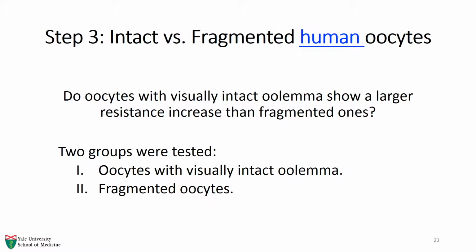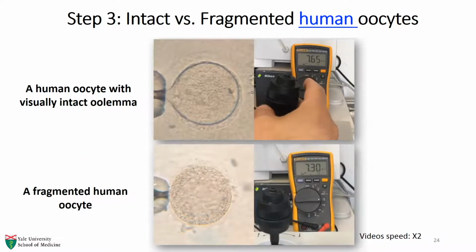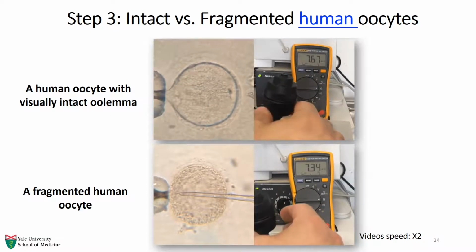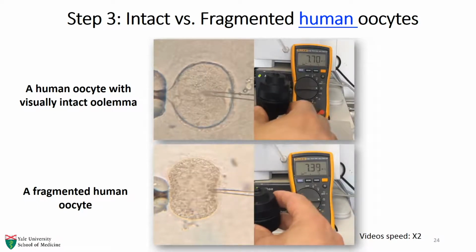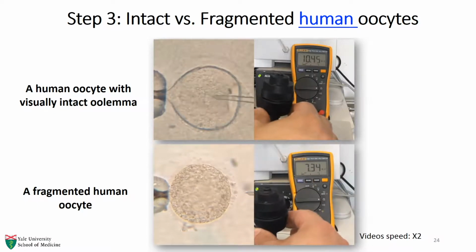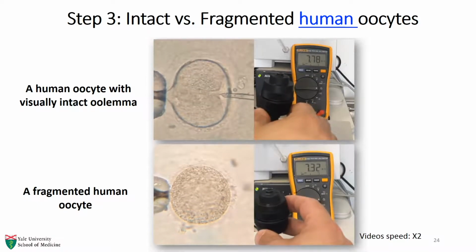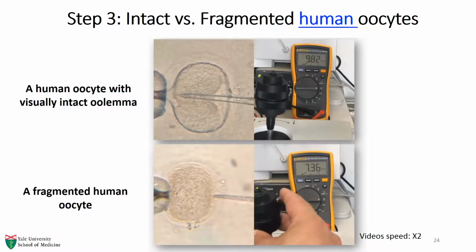In step 3, we studied the electrical resistance change in human oocytes using a commercial ICSI system. In the top video, we see a large resistance increase when penetrating the oocyte with a visually intact oolemma. Please note that leaning against the oolemma does not result in a significant resistance increase. In the bottom video, the fragmented oocyte does not show a significant resistance increase, as in step 2.